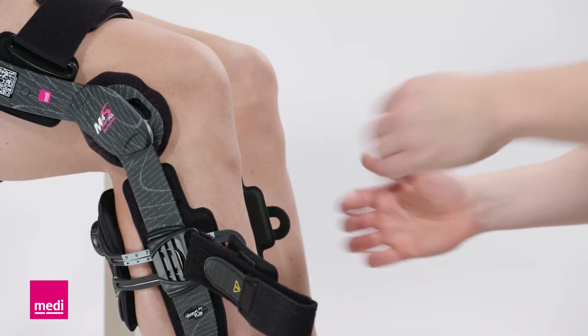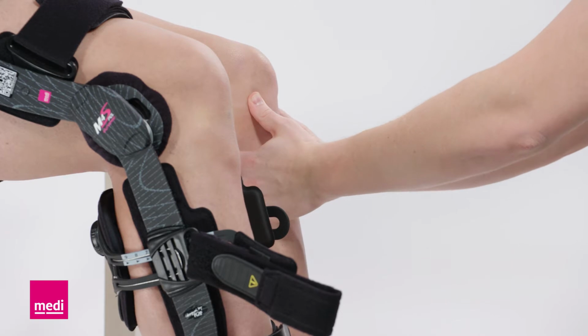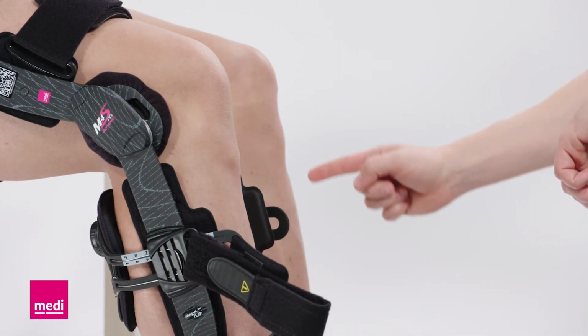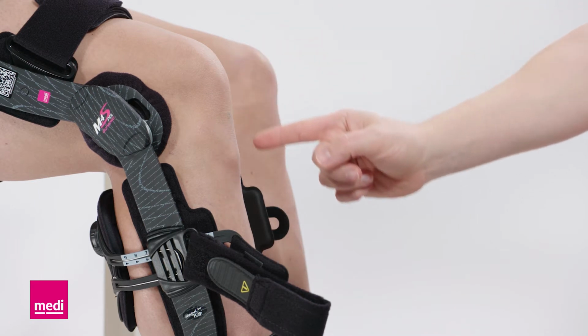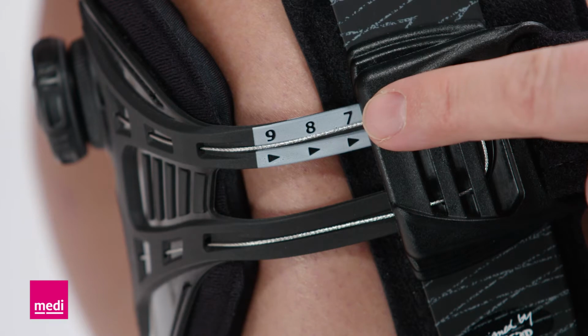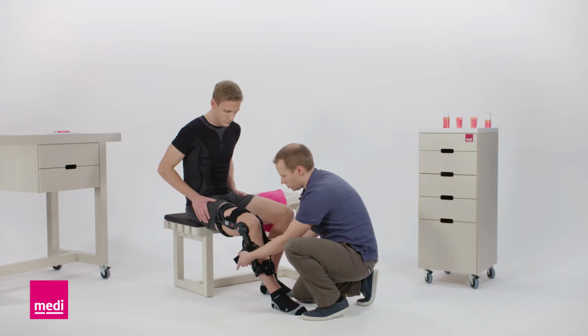Touch the protruding tibia plateau with your thumb. It should have the same shape and feel as in a healthy leg. In a visual comparison, both ankles should be parallel to each other. The indicators on the guide bars can be used as a reference for the position of the support pad.